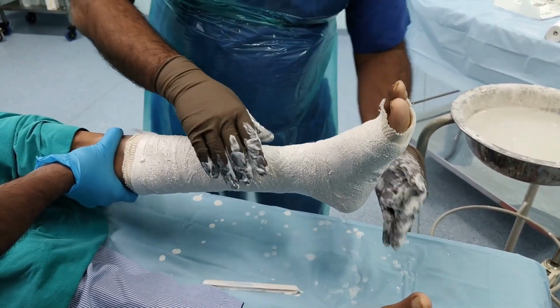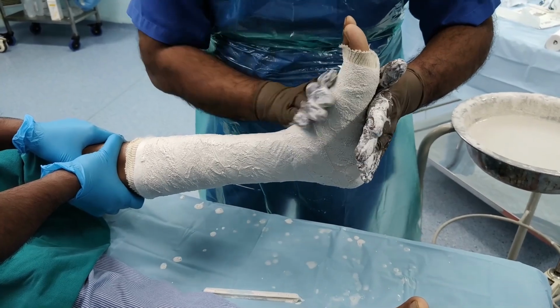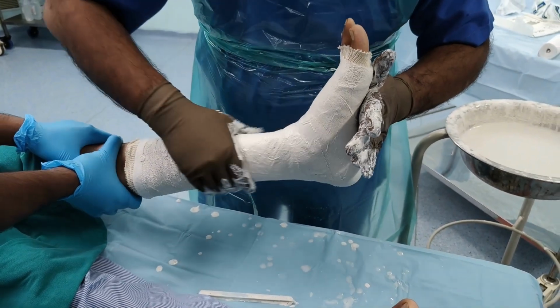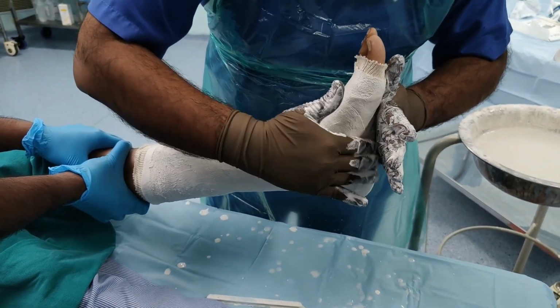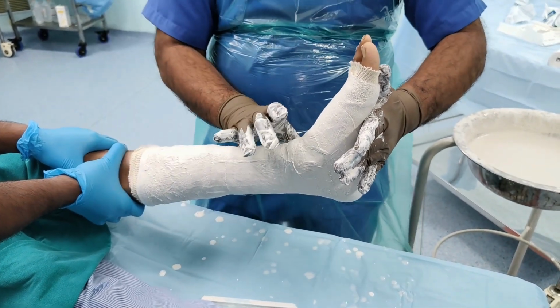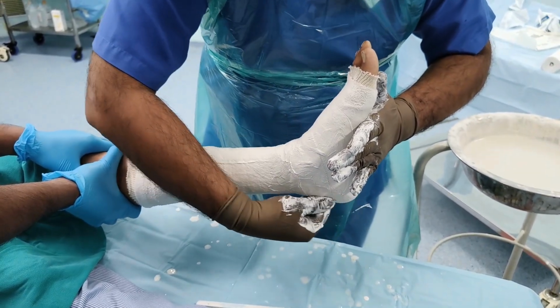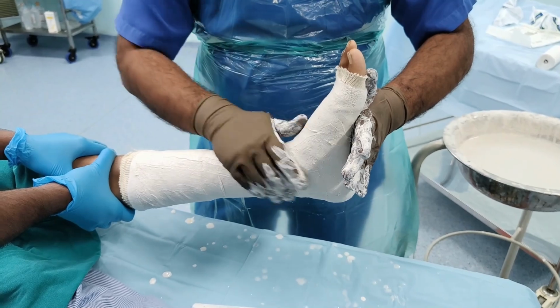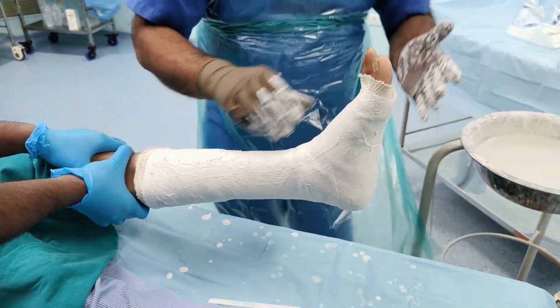Once your one roll is over, you just smoothen it out and contour it to the anatomy of the leg and foot. I am molding it here in the arch, then around the malleoli, around the lateral malleoli, around the tendo-Achilles and the heel, and then I just smoothen it out. Once it is smoothened, I go to my next bandage.